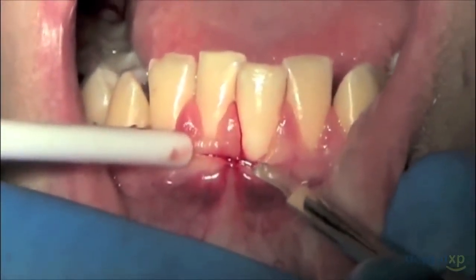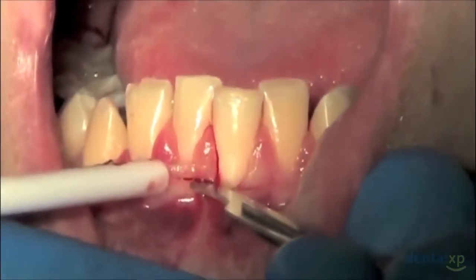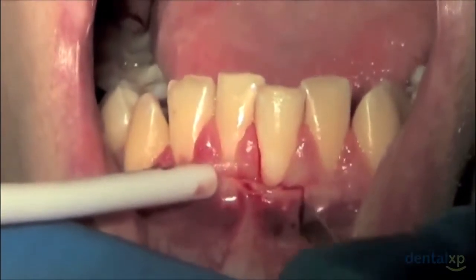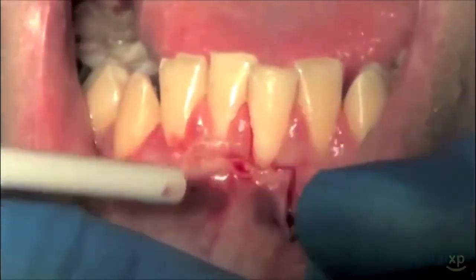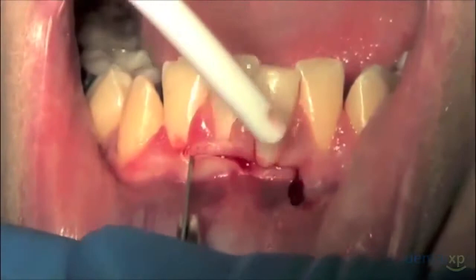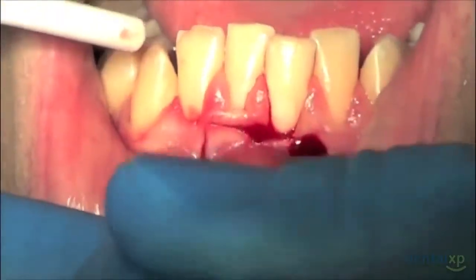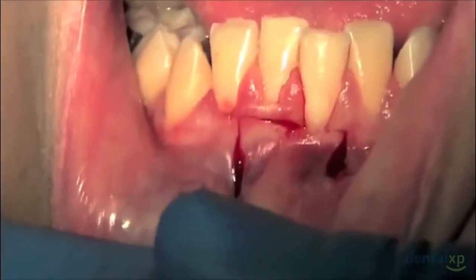What I like to do with my incisions here is go all the way to the bone or the root surface. At this point, we're not trying to be too delicate with any type of partial thickness flap design. The extent of this incision usually extends to a point directly beneath the tip of the papilla. After that, 2 vertical incisions will be dropped and extended into the depth of the vestibule. Care should be taken so that the vertical incisions are not centered upon the mid-surface of the root. Rather, they should be made directly on the bone.